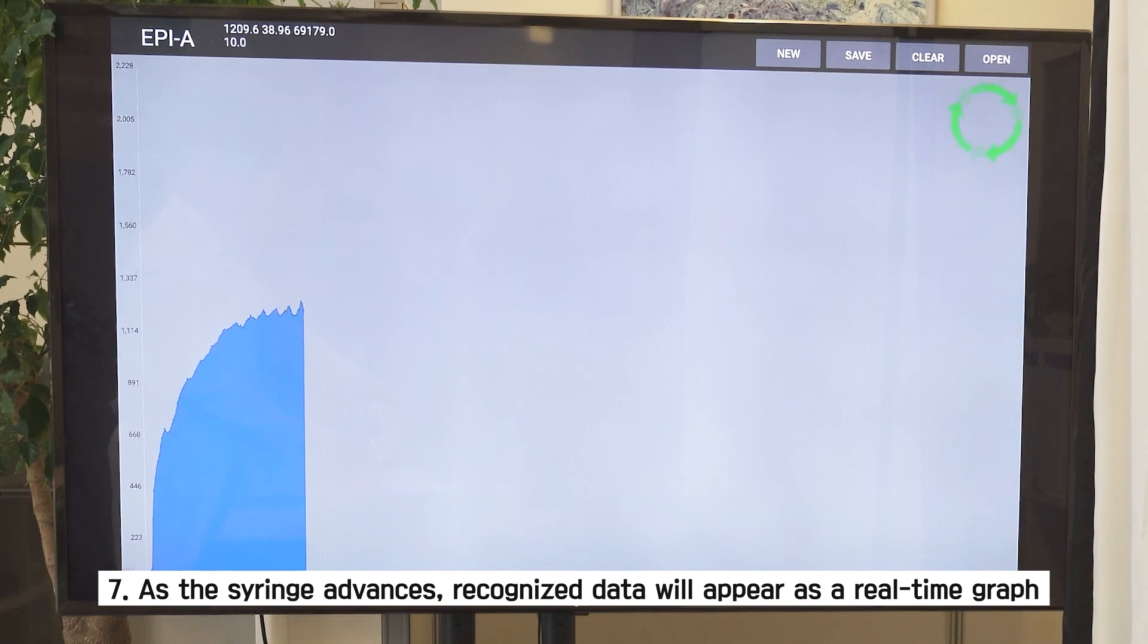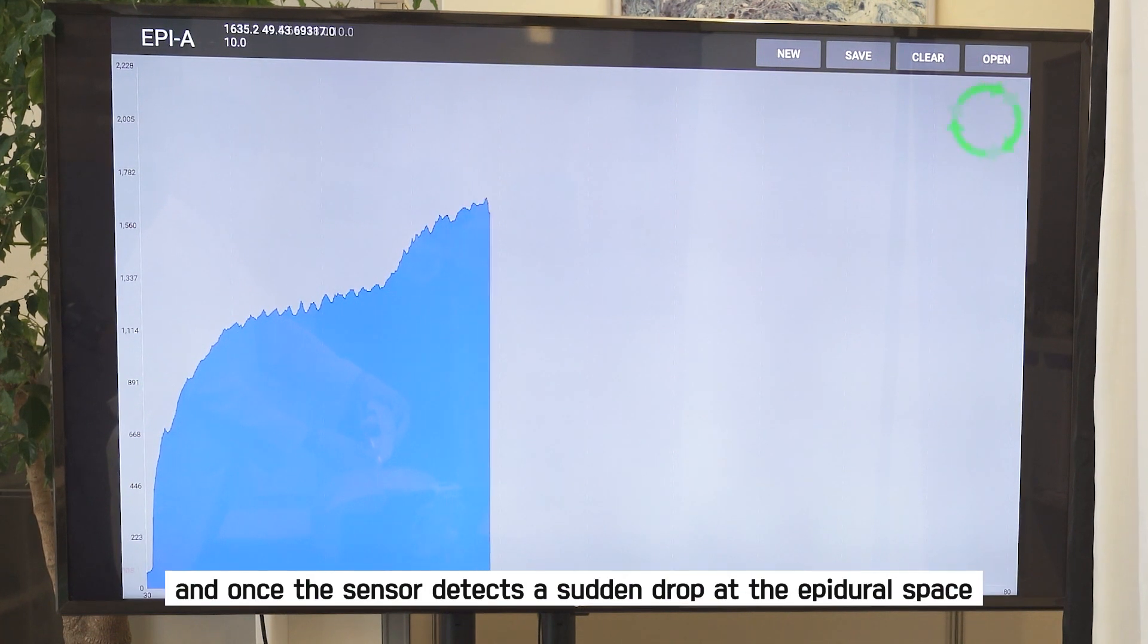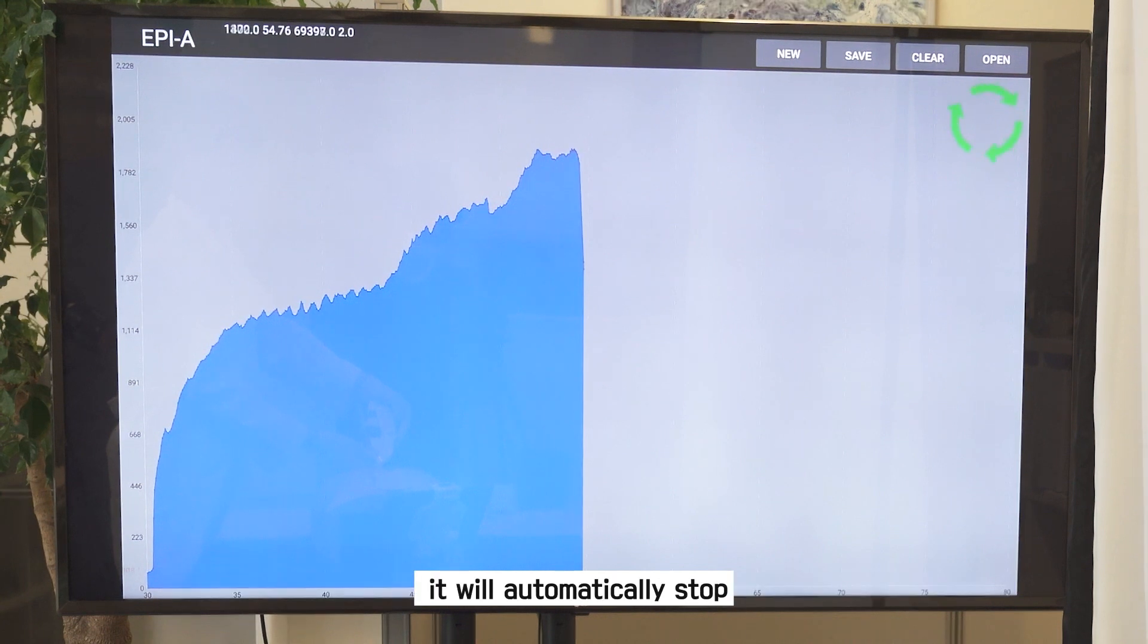Seventh, as the syringe advances, recognized data will appear as a real-time graph, and once the sensor detects a sudden drop at the epidural space, it will automatically stop.